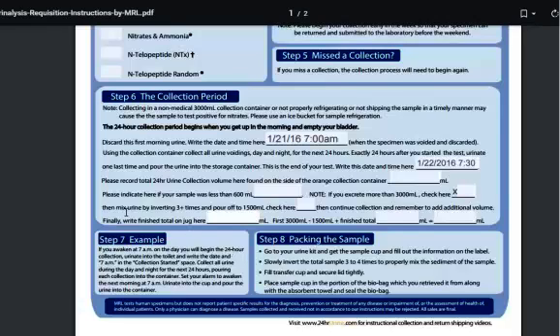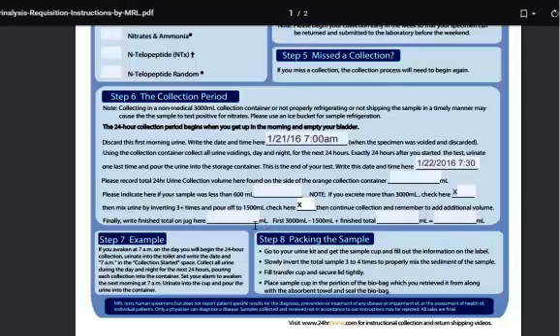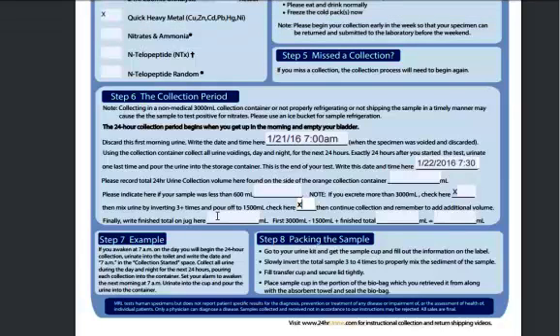Finally, all right, so here's the deal on the 3,000. If you have 3,000, your orange container is full. We will mix the urine by inverting 3+ times and pour off 1,500 milliliters and mark this box. So pour it slowly. You want to mix the sediment up. That's what you're primarily doing, evenly distributing the sediment within the total volume. So we'll mark that because we're over 3,000 milliliters on this client. Finally, write the finished total here.